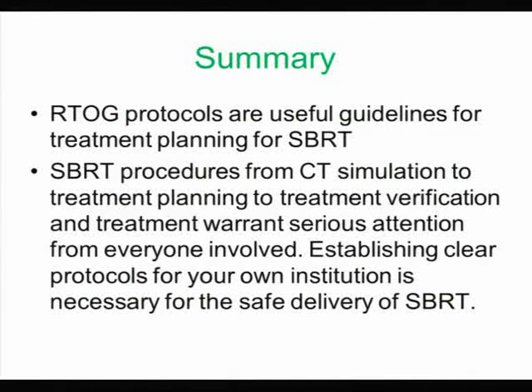So you really have to instill in them this clinical mock-up. The dry run has to be a clinical mock-up. You have to make sure your plan can be carried out without problem. And also, attendings, when they select patients, really should follow ASTRO's guideline about what kind of patient is suitable for SBRT. You cannot have a patient in very bad physical condition. They cannot tolerate such a long process. So that is also the time you find out the patient's condition, during the dry run.